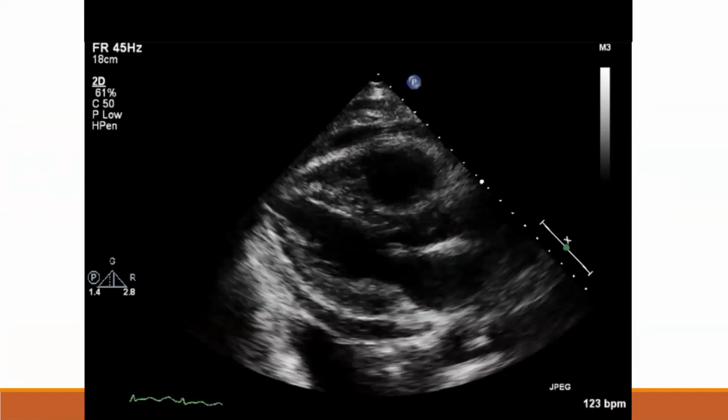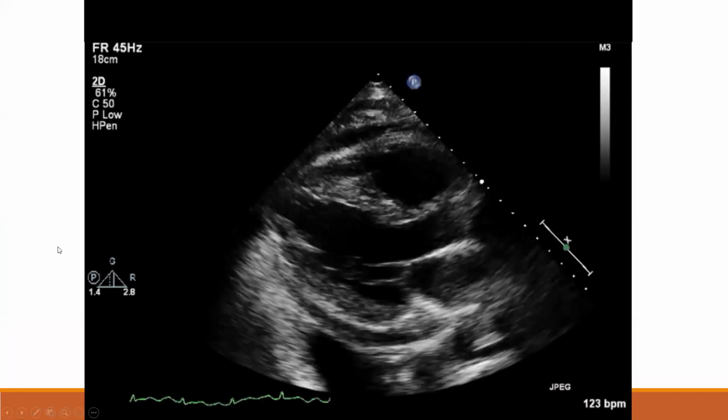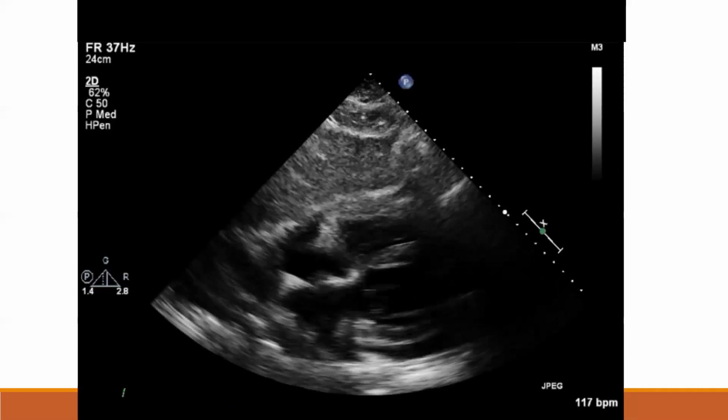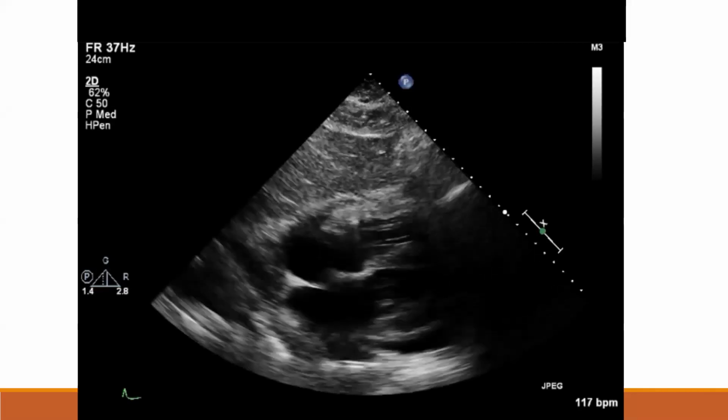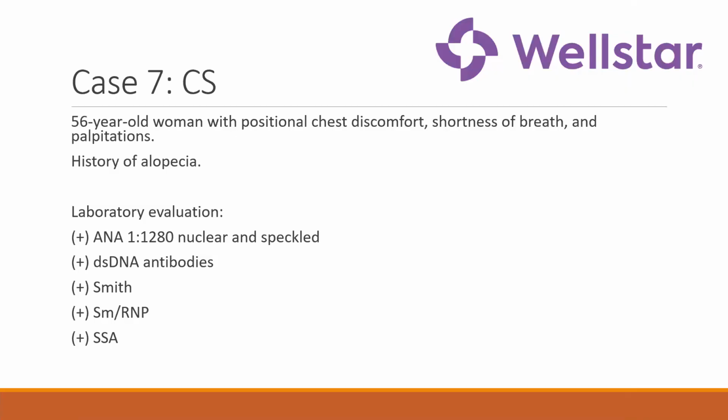And here's the patient's parasternal long axis, which shows a pericardial effusion and obviously tachycardia in that setting. Here's the patient's subcostal image. You can see there's not tamponade as the right atrium is filling appropriately, but you can see that there's a pericardial effusion. And coupled with the patient's presentation, this certainly represents pericarditis. So the laboratory evaluation in this patient, she had a positive ANA, positive double-stranded DNA, and positive Smith, RNP, and SSA antibodies as well. So given her pericardial effusion, history of alopecia, ANA, and positive double-stranded DNA, she has systemic lupus erythematosus.